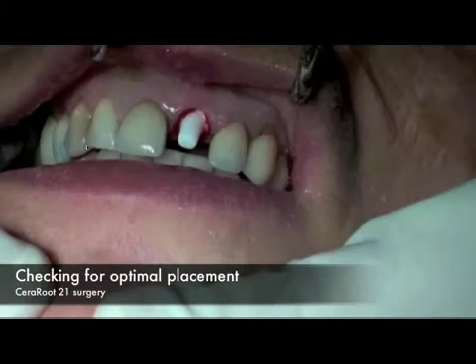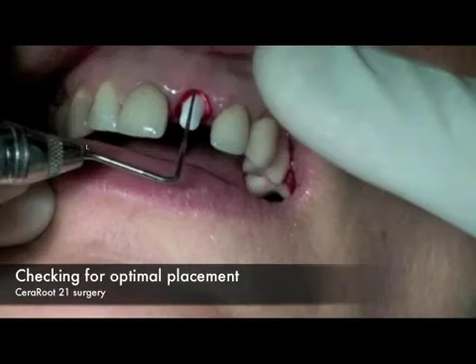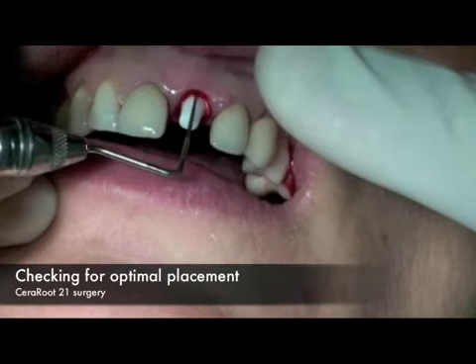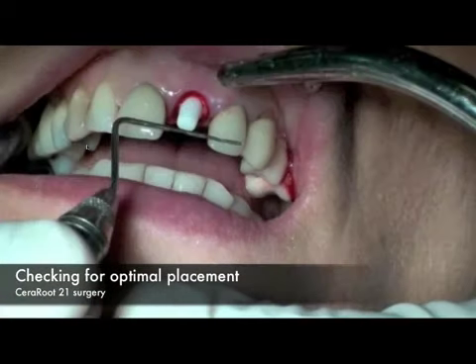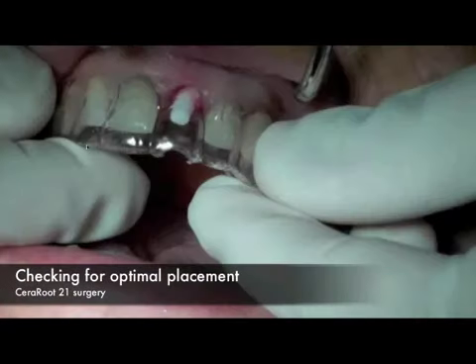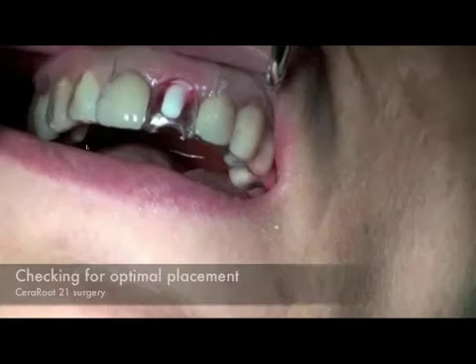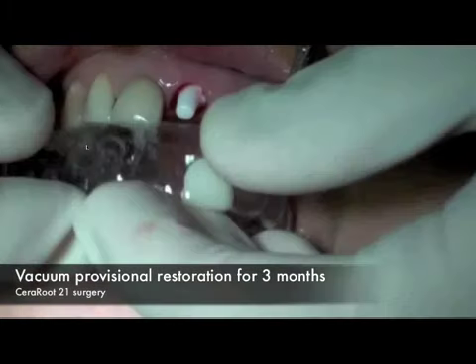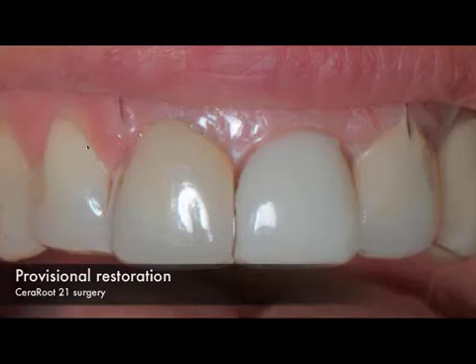And you can see enough palatal clearance for the restorative material as well. We're going to now show the facial clearance to show that there are no angulation issues with this. So see, with the probe carried against the other teeth, we have enough clearance facially. And with the Essex appliance in place, we fill up the Essex appliance with some composite, and this is our provisional. And this is what the patient heals with until we're ready to load the implant.